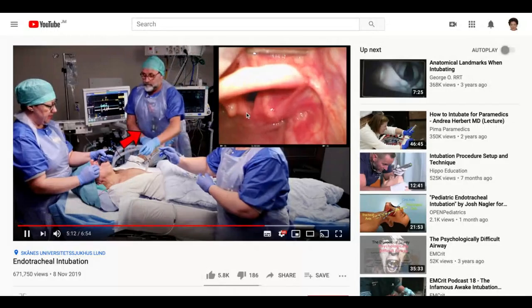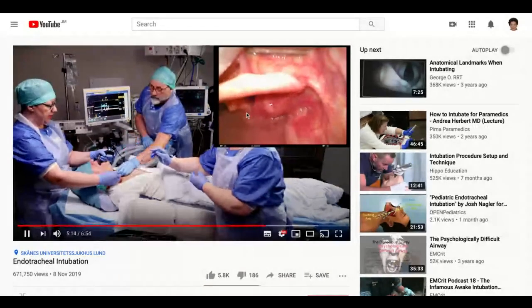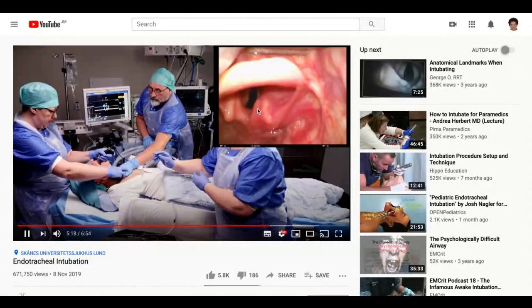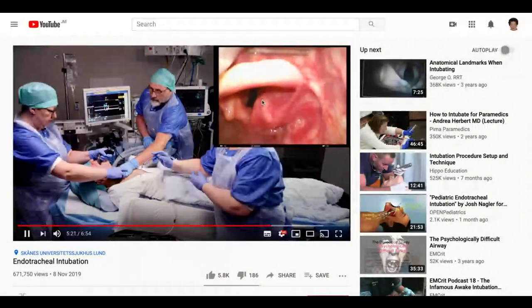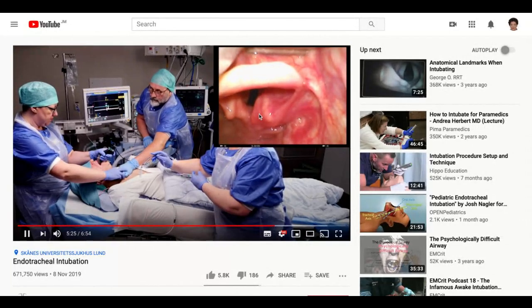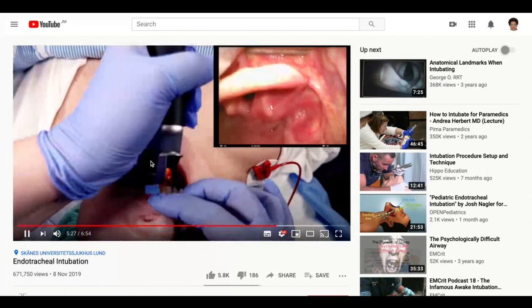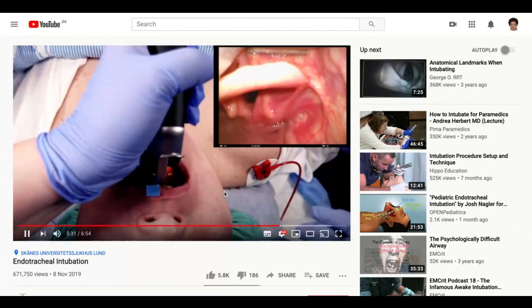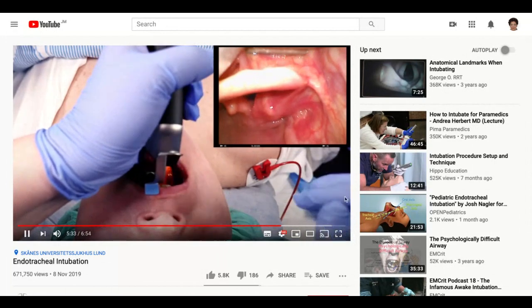I know where the trachea is. See? Sometimes a light external force on the larynx can make the vocal cords spring to view. Ask your assistant to put her hand on the larynx and move it backwards, upwards, rightward pressure, or BURP for short. See? Make sure you don't pinch the lips and do not exert any pressure on the incisors.